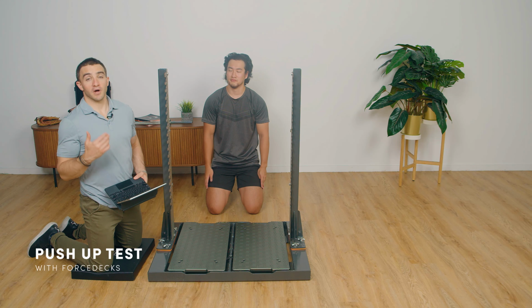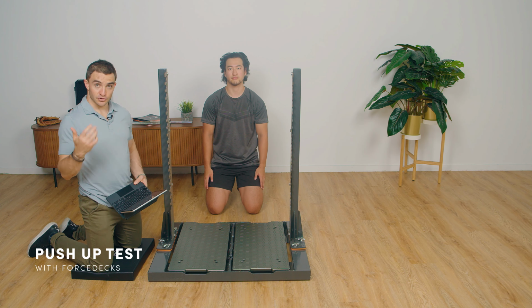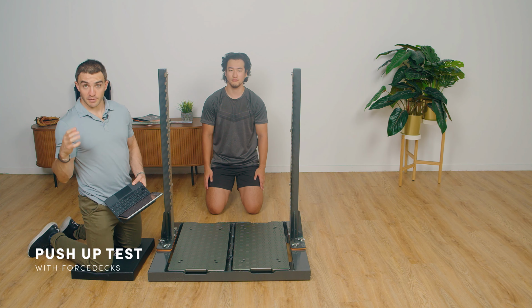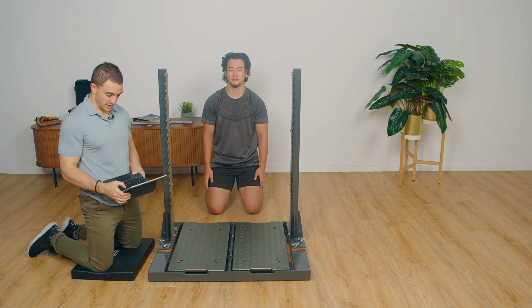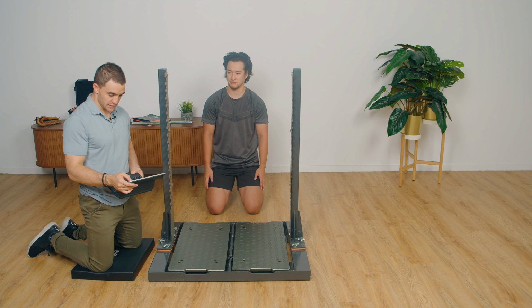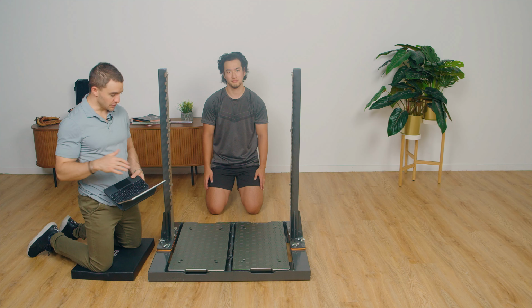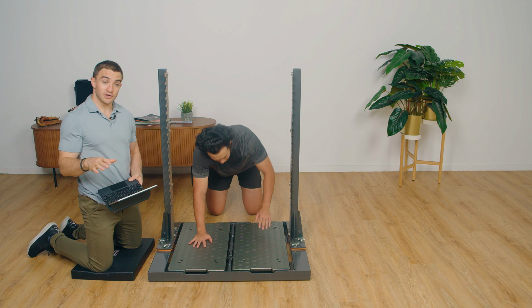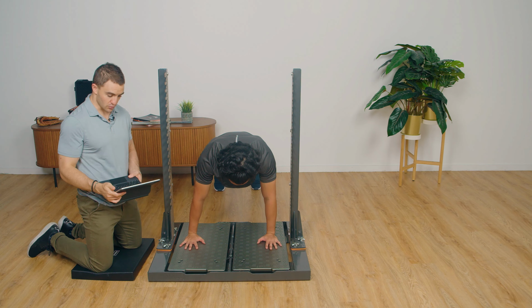So when we become comfortable with the patient's ability to bear weight through their upper limbs, we then want to start to introduce things like a pressing pattern, so we can implement push-ups and we can quantify the different characteristics of the push-up using the force decks. So what we'll do is we'll look at a few push-ups, and I just want to see what Cal would normally do. So Cal, when you're ready, now what we can do is we can start in a kneeling position, but for the purposes of this prac, we're just going to go straight into a normal push-up.